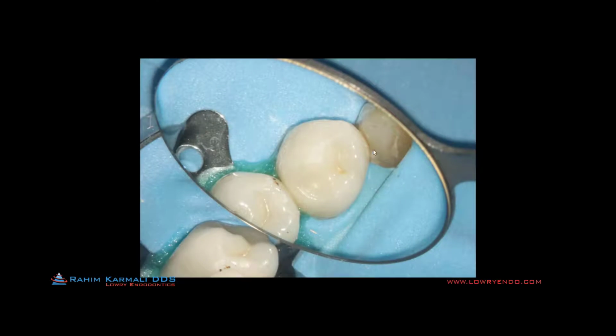This is the sagittal view on the CBCT. You can see the deep split which was managed, but here's the third branch which wasn't. So the CT really gives us insight as to why this case isn't working and how we can better address it in the retreatment. This is the tooth prior to access.